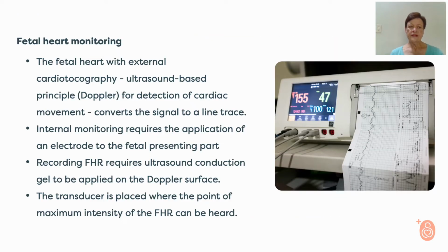Now, if we just look at the fetal heart monitoring part, it works on an ultrasound-based principle, a Doppler principle, where the transducer picks up the cardiac movement and converts the signal to a trace line on the CTG, as we can see.